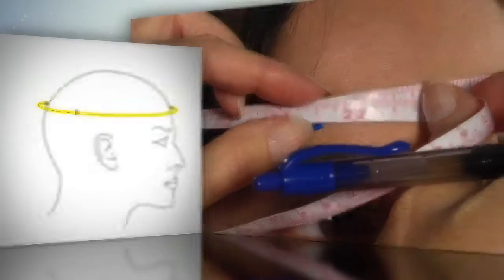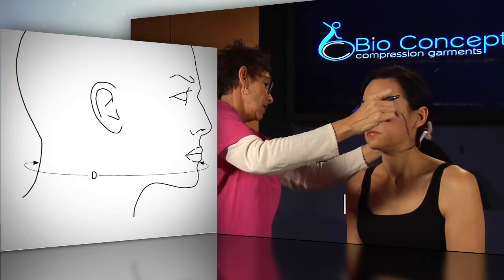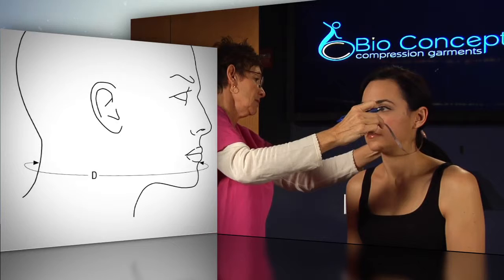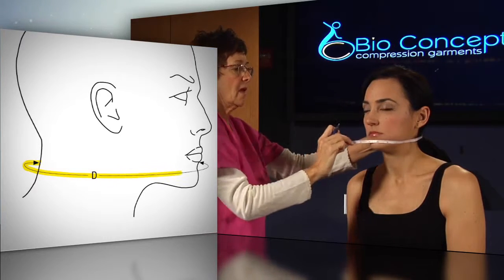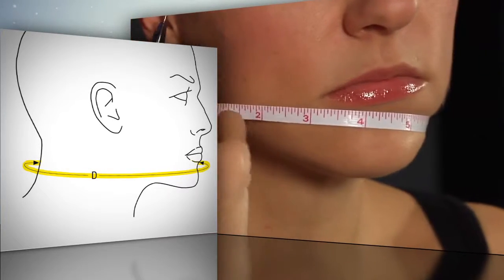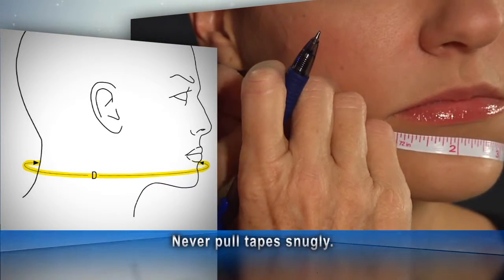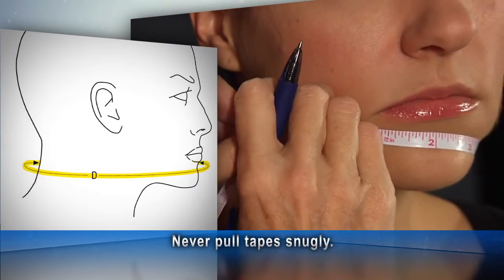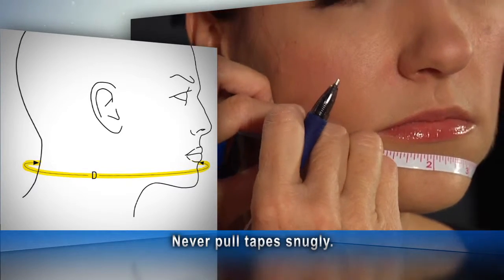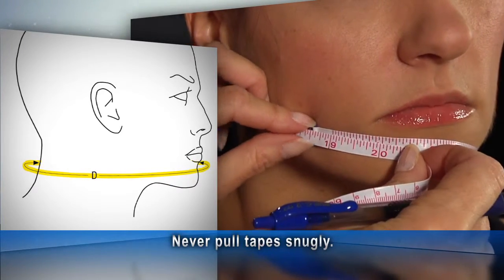There is no capital C measurement. Measurement capital D is around the base of the head, from the nape of the neck to the chin. Place the tape on the nape of the neck between the lip and the point of the chin. Note that the posterior position of capital D is the same as capital E — only the anterior positions have changed.